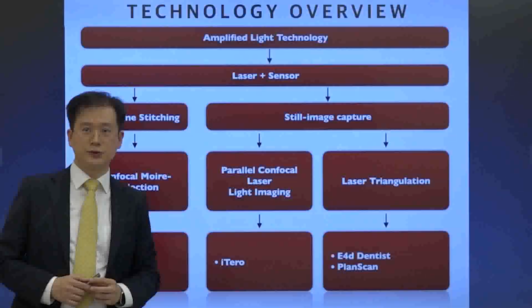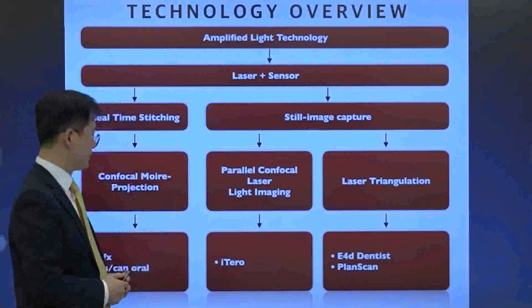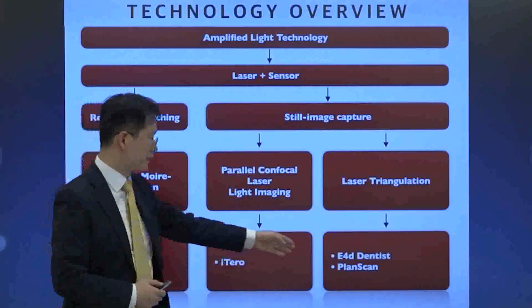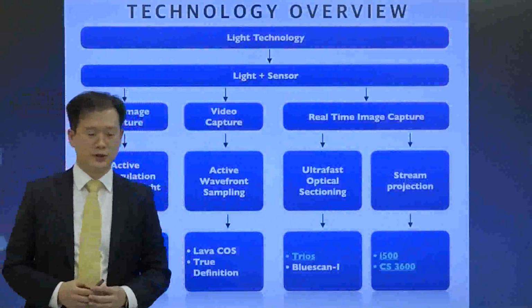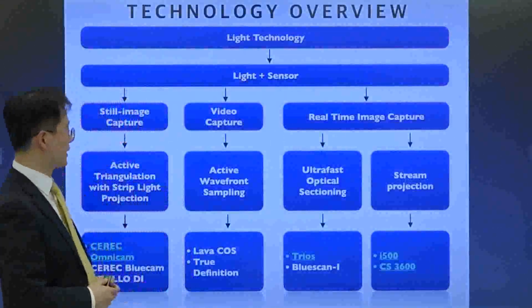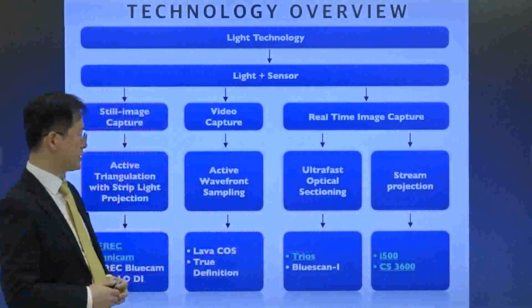Intraoral scanners which utilize a laser as the light source include iTero and Plan Scan. The light-based scanners are Trios, i500, and CS3600.